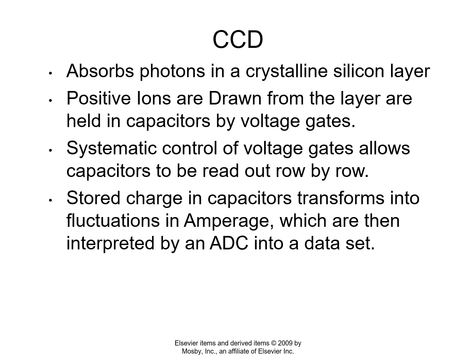All right, and so you funnel these positive ions onto these capacitor plates, but then you have control capacitors or gates on either side of those, so the positive ions don't really have anywhere to flow. The gate can be open, very much like a gate to a herd of cattle. The gate can be opened and closed by controlling the gate circuit, which is all the way on the bottom of the CCD. So when we open the gate, it allows the positive ions to run out of the capacitor into the next area. And so let me show you that on the CCD schematic.